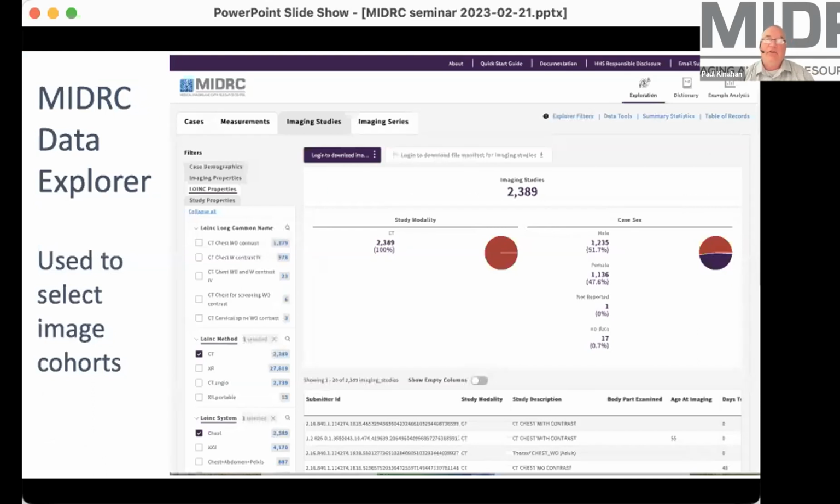If you can see it, it's a little hard to see on the PowerPoint slides. But I encourage you to explore it. Just go to MIDRC and you can launch this and see the studies. And now with the combination of the attributes and the mapping table, you can go through and sort by the LOINC properties, which would be the long common name, or it could be the method, which is the modality, or the system, which is the body region or other parts.